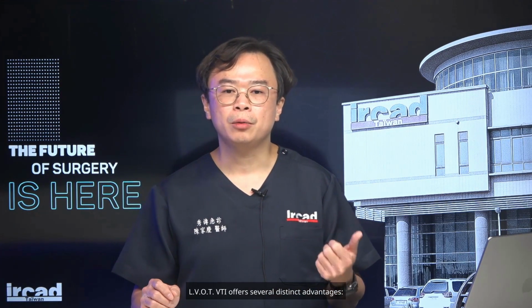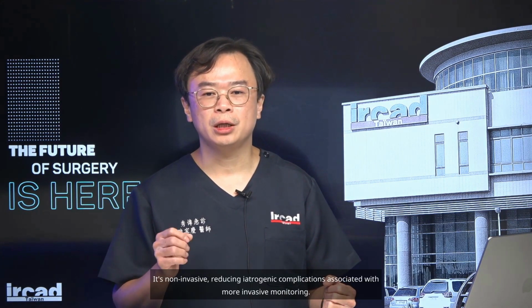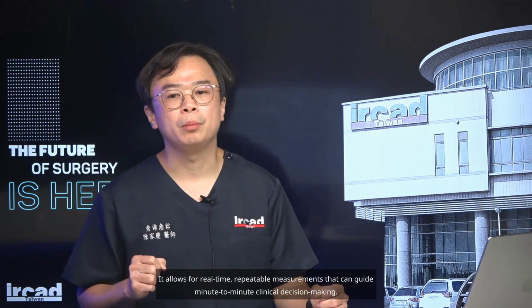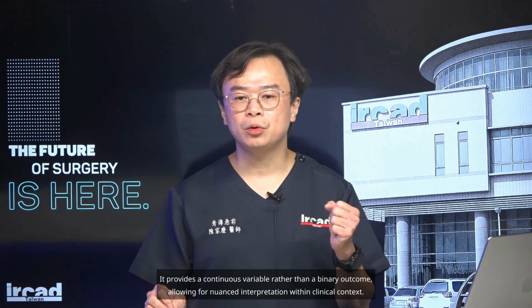LVOT VTI offers several distinct advantages. 1. It directly measures stroke volume, which is the fundamental parameter we're trying to augment with fluid administration. 2. It's non-invasive, reducing iatrogenic complications associated with more invasive monitoring. 3. It allows for real-time, repeatable measurements that can guide minute-to-minute clinical decision-making. 4. It provides a continuous variable rather than a binary outcome, allowing for nuanced interpretation within clinical context.